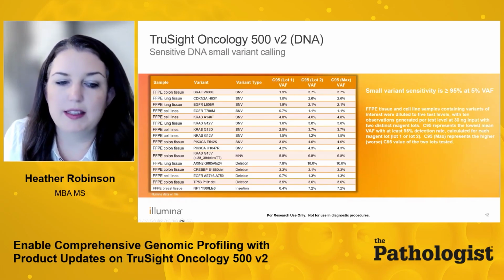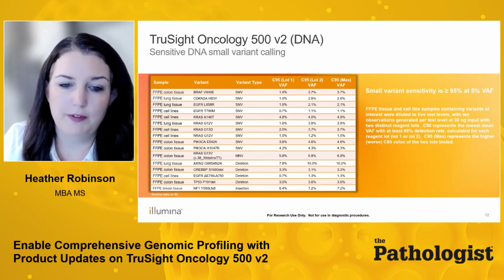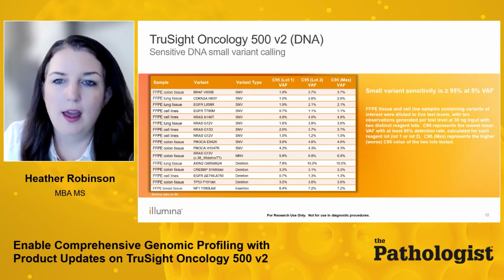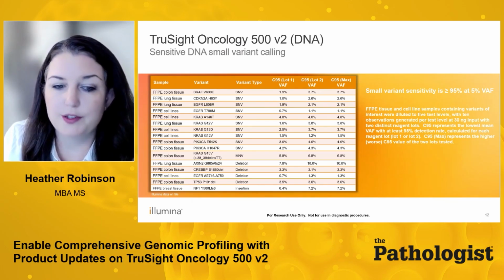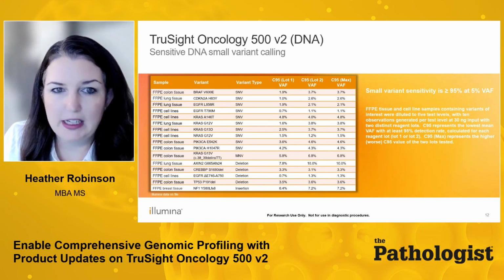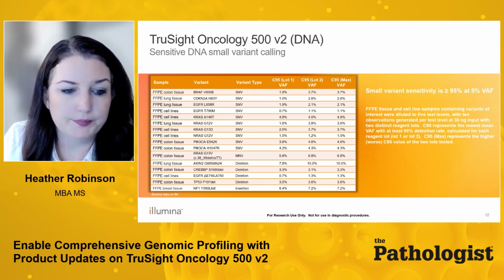This table includes examples of small variants that were detected with TSO 500 V2, with variants as low as 1% VAF. 5% VAF is verified as the limit of detection for small variants for at least a 95% detection rate, and variant calling will depend on the quality of the sample.